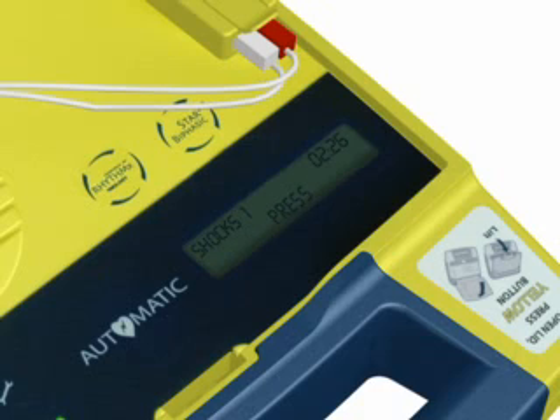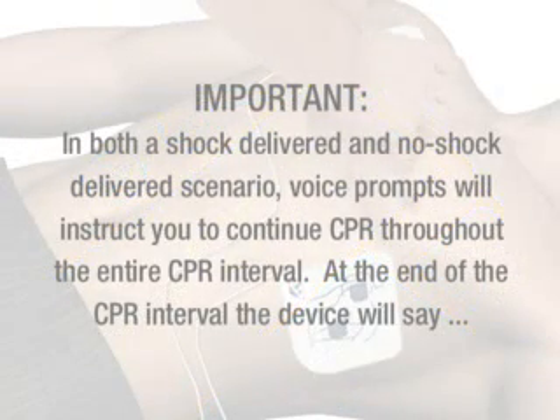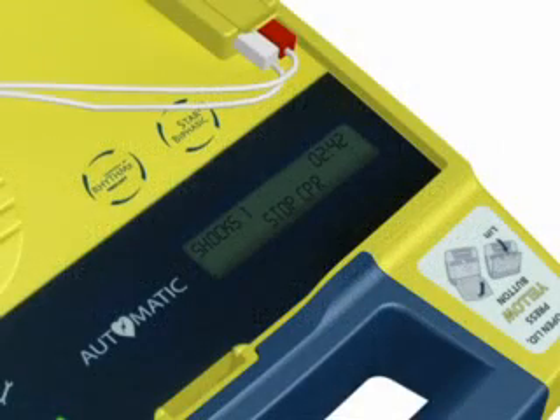Continue with compressions. Press. Press. Press. Press. Press. Stop CPR.